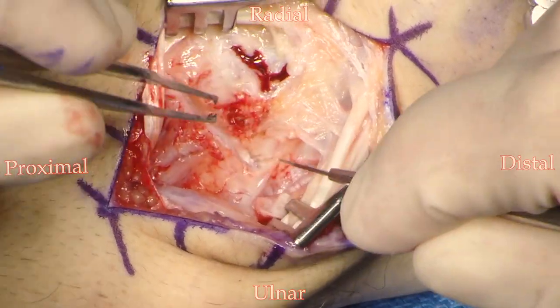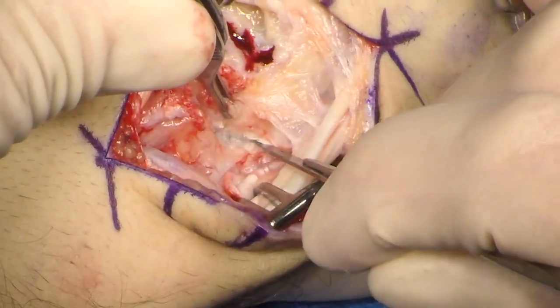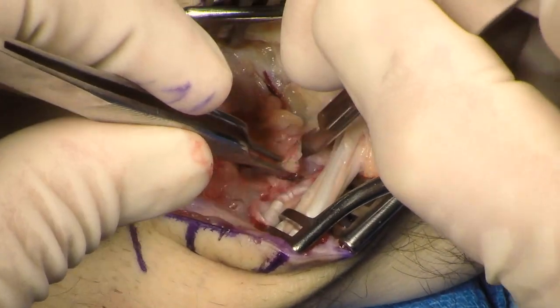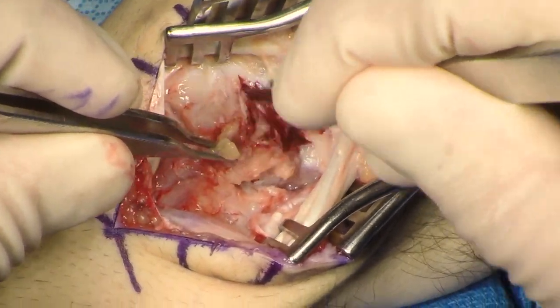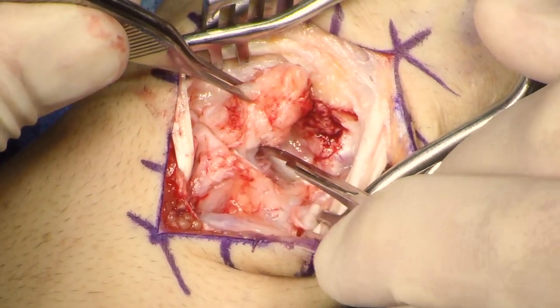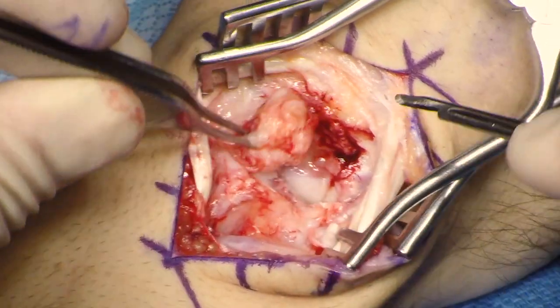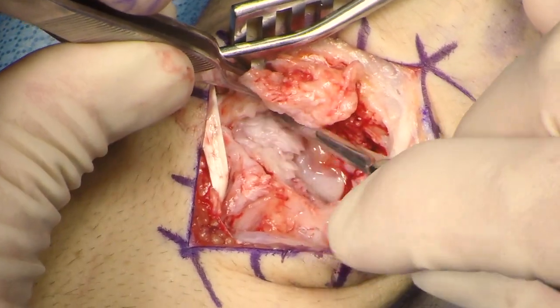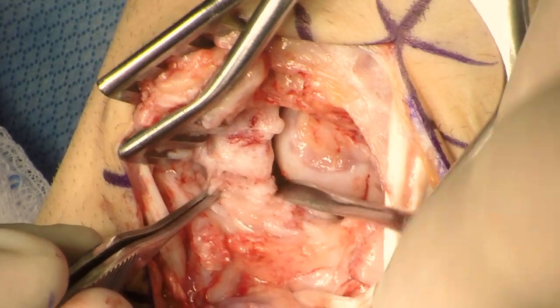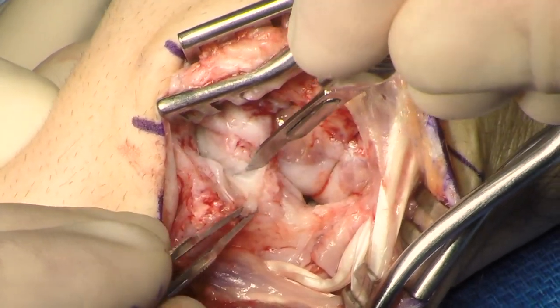The distal radial ulnar joint is identified, and the incision is taken distally and ulnarly in line with the fibers of the dorsal radiocarpal ligament. A transverse capsulotomy is then made just distal to the dorsal intercarpal ligament, and the capsulotomy is elevated from ulnar to radial. Care is taken to preserve the scapholunate ligament, which will be needed later for the reconstruction. The capsulotomy is elevated to just past the nonunion site.